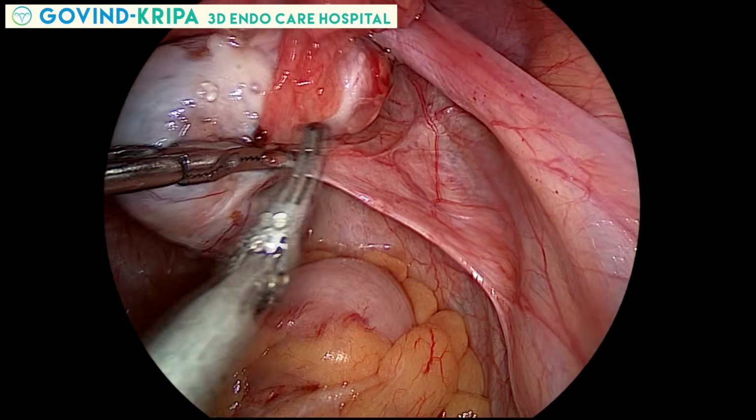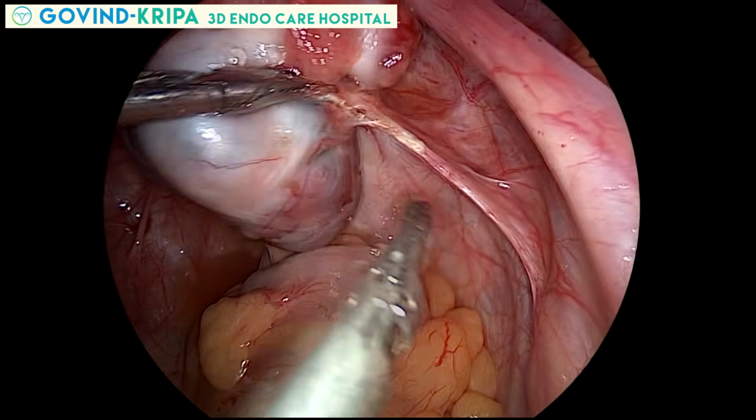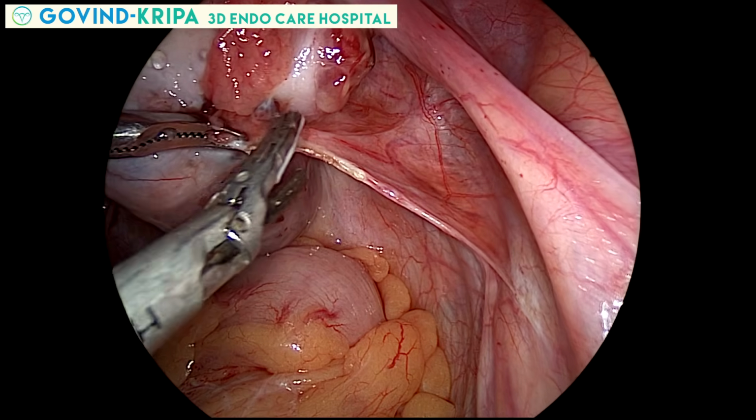Right ovary is lifted up and released from the ovarian fossa, and also this is made free from the rectal fat medially.